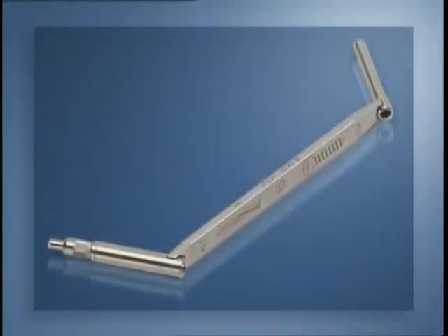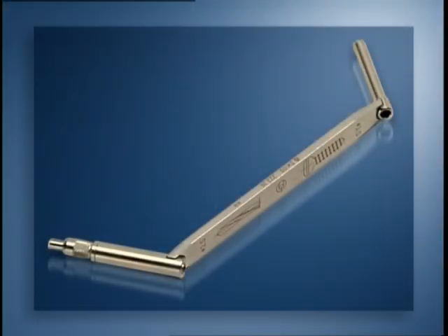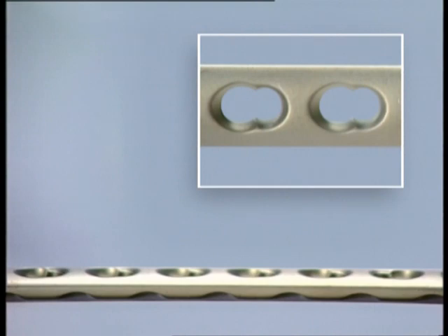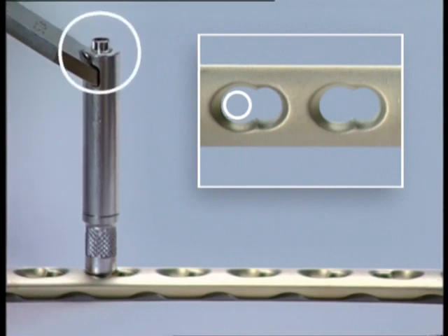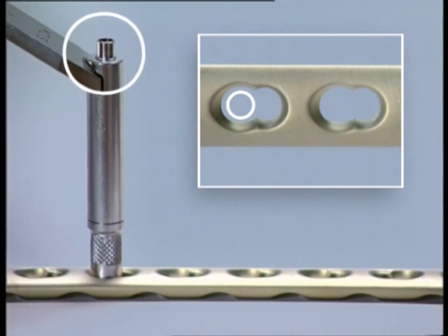The eccentric and neutral pre-drilling for the standard screws has to be carried out with the universal drill guide. To pre-drill eccentrically, the universal drill guide is placed at the edge of the dynamic compression portion of the combination hole. To pre-drill in the neutral position, the universal drill guide is pressed into the hole, revealing the telescopic inner sleeve.